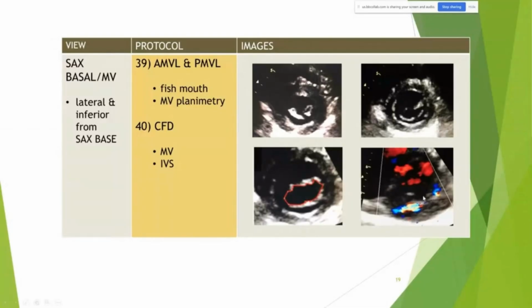Because if you were in systole, the aortic valve and the pulmonic valve are supposed to be open. So you wouldn't get aortic and pulmonic insufficiency in systole. They would have to happen in diastole. Does that make sense? Yes. Okay. Remember, it can only happen when the valves are closed, but that depends on the cardiac cycle and the type of valve that's supposed to be open or closed.